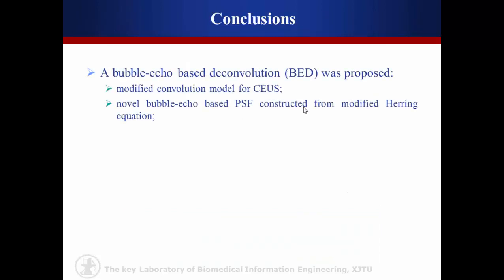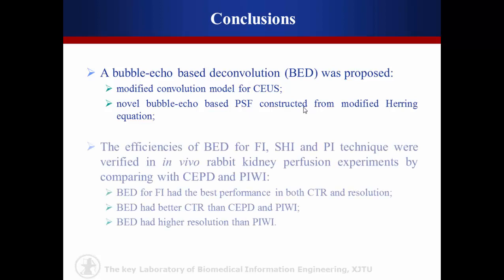And then the conclusions. A bubble echo-based deconvolution was proposed, where it is based on a modified convolution model, and a novel bubble echo-based PSF was constructed from the modified Herring equation.